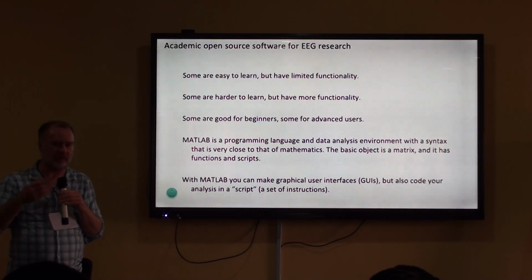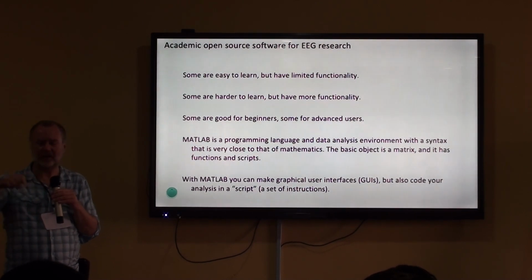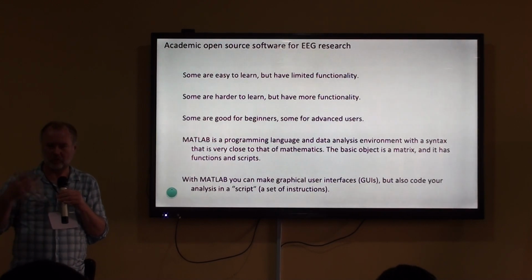Whereas if you start using graphical software, the first step seems to go fast, but actually it's not very fast, and it's not going to get any faster either, because you constantly have to click around. Whereas with scripting and coding, you can make your analysis much faster.